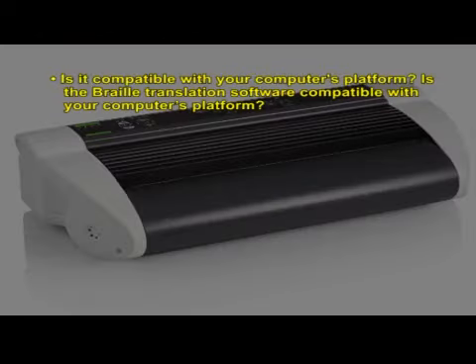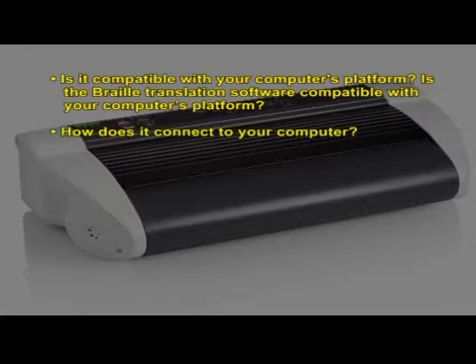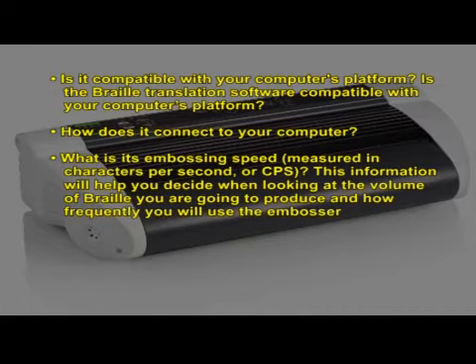Is the Braille translation software compatible with your computer's platform? How does the embosser connect to your computer? What is its embossing speed? Is it measured in characters per second? This information will help you decide when looking at the volume of Braille you are going to produce and how frequently you will use the embosser.